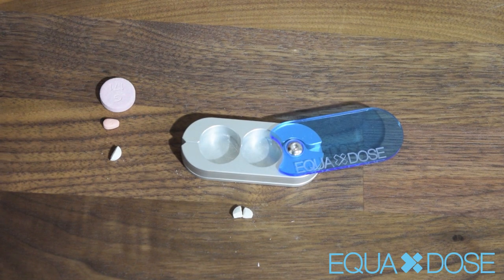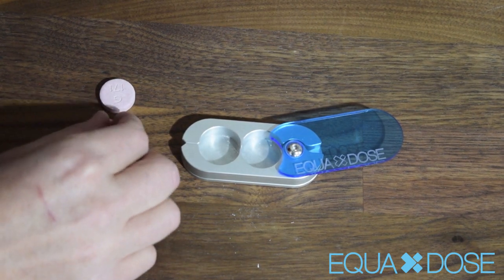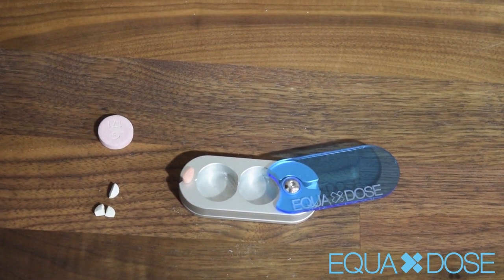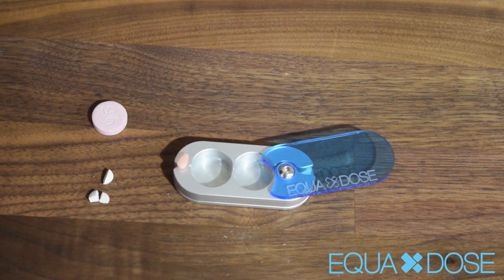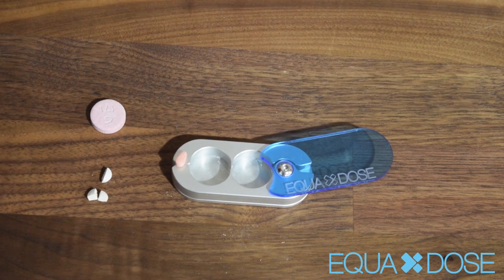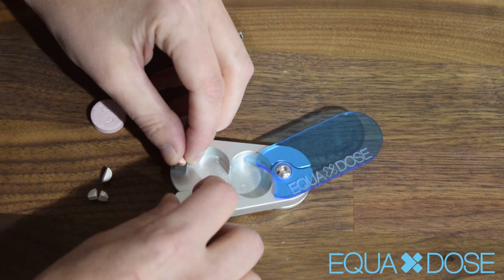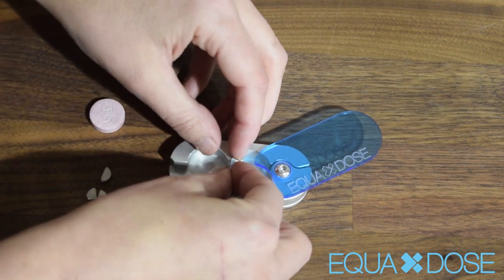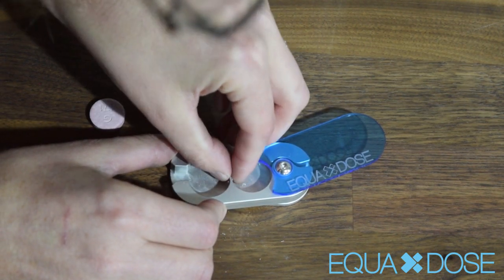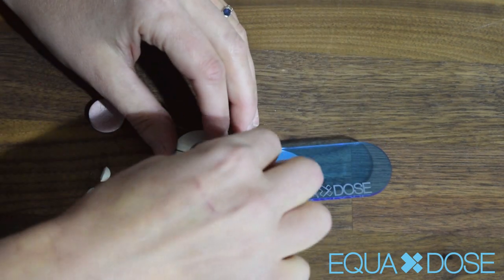Next we're going to do kind of an odd shaped pill. This is quite commonly — we'll have people ask us about a triangular shaped pill or one like this, like an egg shaped pill. Now obviously you'd have a pretty hard time getting quarters out of this, but you can do halves. With this one, you're going to put the long side just up in the blades and just center it again, same way you always do, cover it over, and then I'm going to show you these halves.